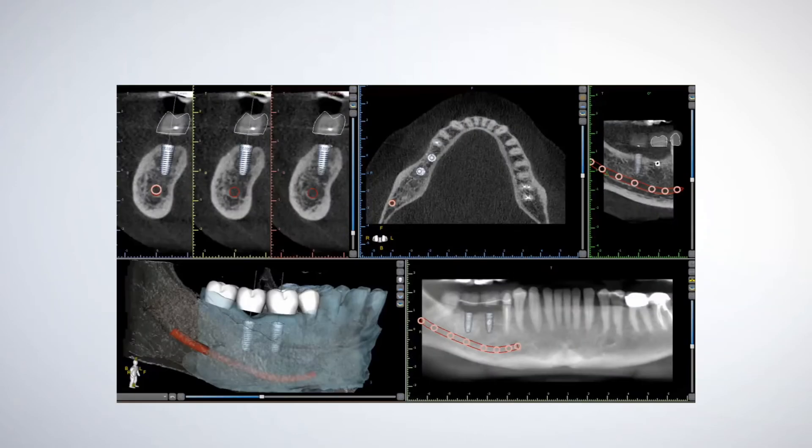Creating a vacuum formed GRS surgical guide over 3D printed model utilizes the precision and accuracy of 3D implant planning software. Using 3D implant planning software, a virtual anatomic model is created with the desired angle, orientation, and depth of one or more implants.